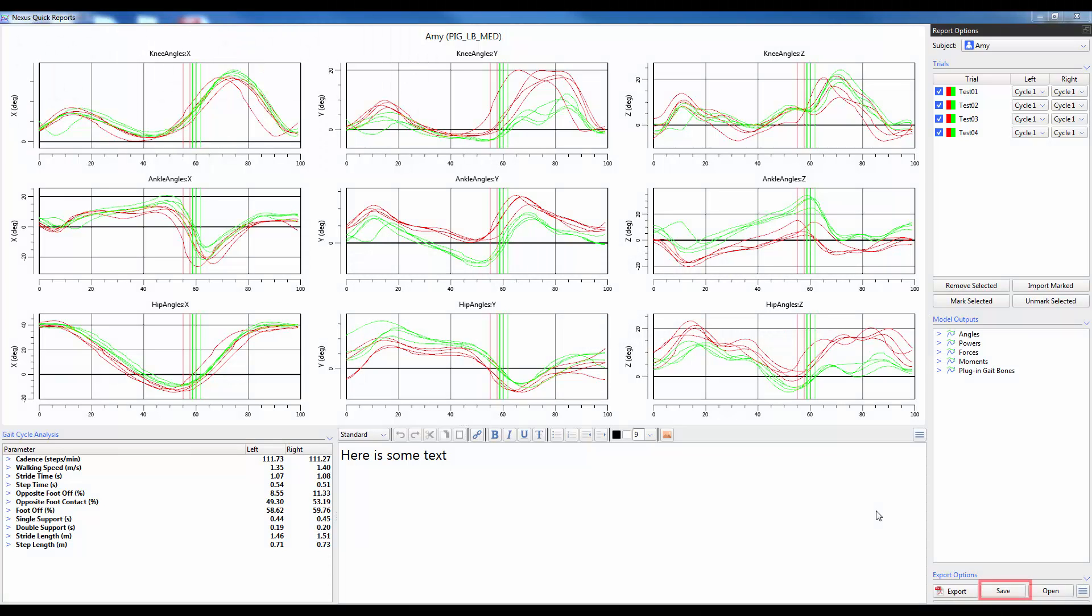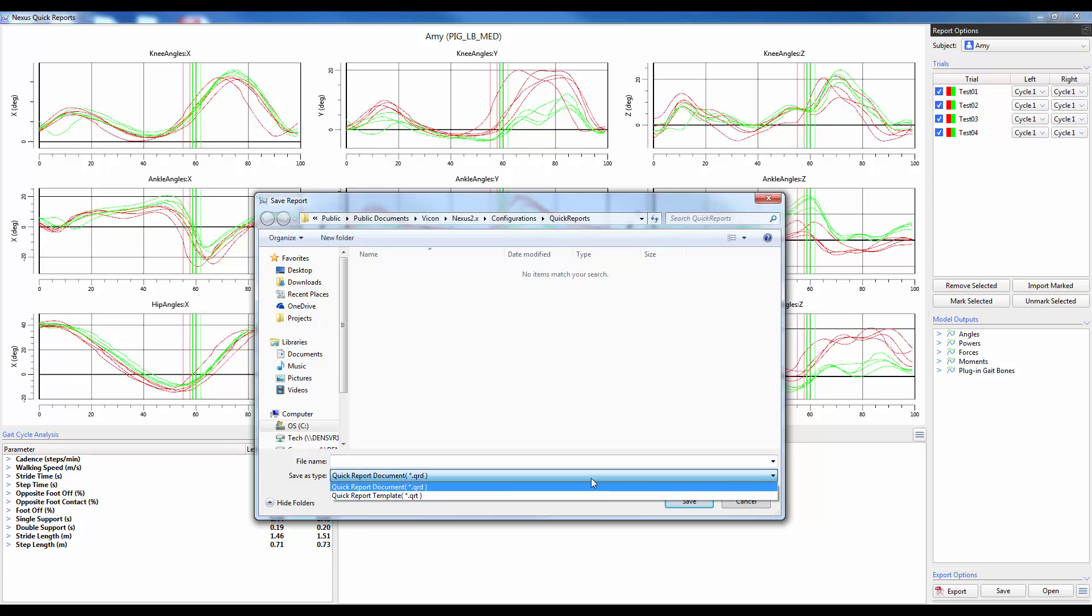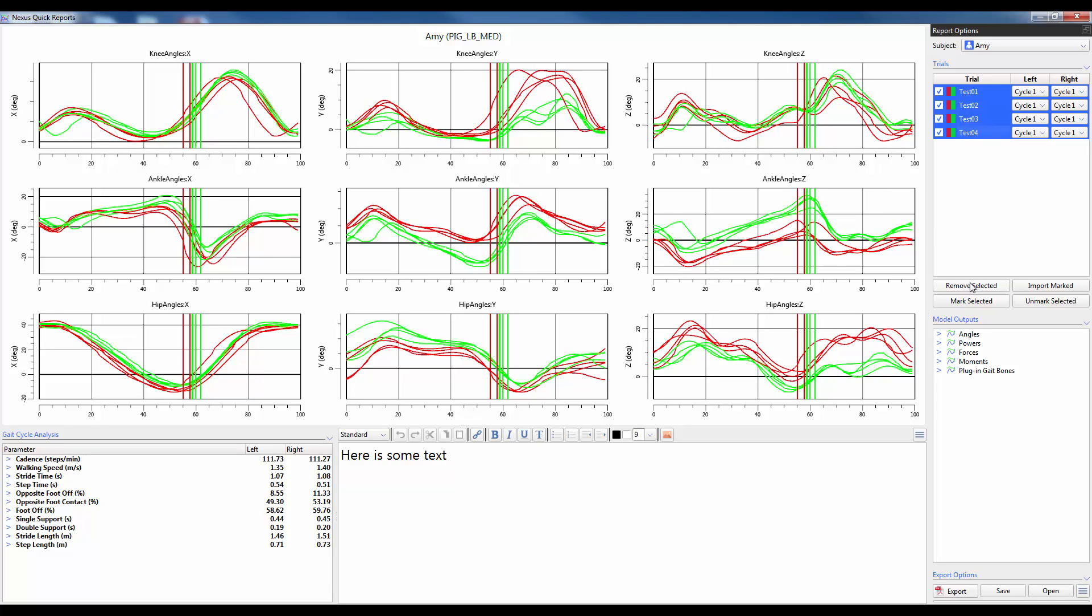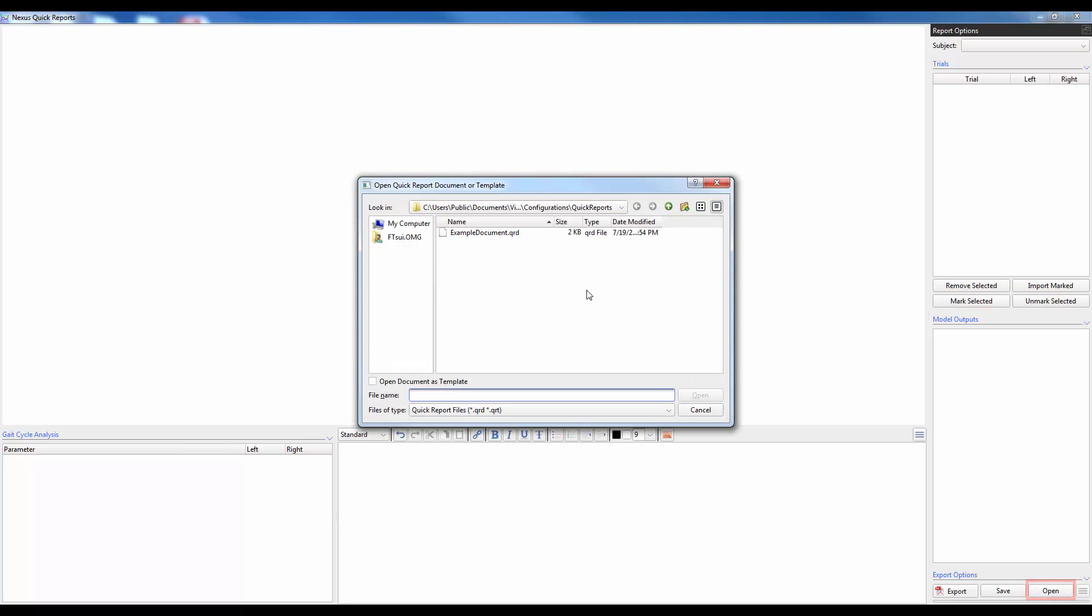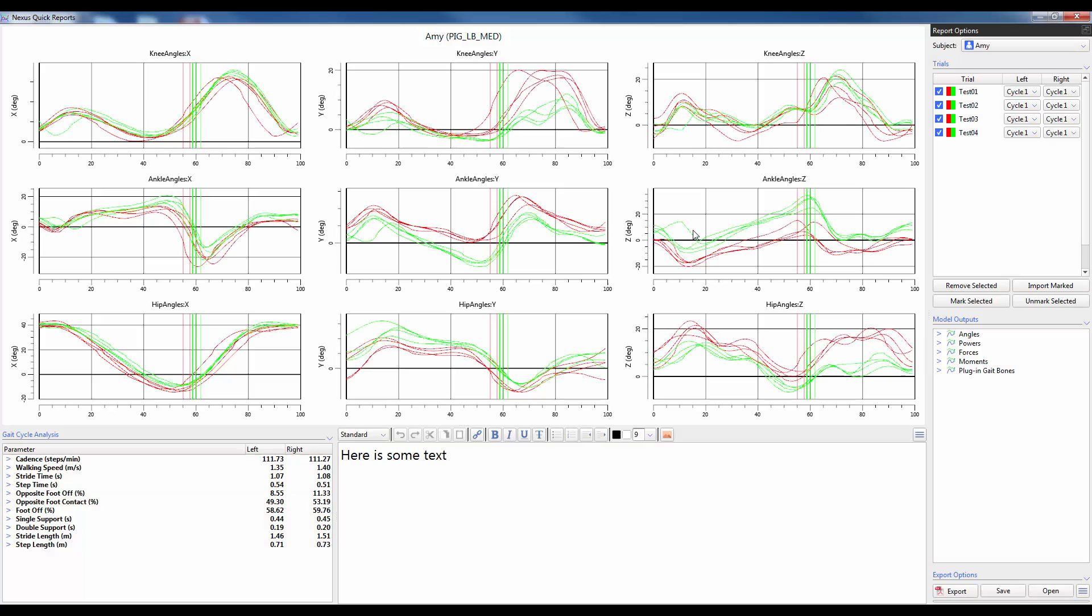To save a report, I will click on the save button. In the new dialog, I have two options for saving. I can either save the quick report as a document or as a template. I will first show you the document option. So I will give the document a name, example document and go ahead and click save. I will then go ahead and clear this report so that it goes back to its default formatting. To open this report, I will go ahead and click on open and select example document. We will see that it populates the exact trials that I had previously saved as well as all the formatting and the text.